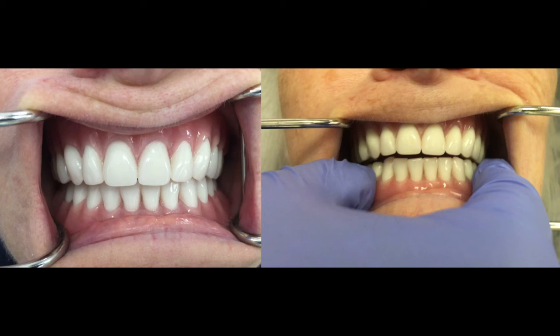So when you check the occlusion in a denture, be careful not to rely on the patient's habitual bite, because the denture may move and shift, so you will not be able to recognize the malocclusion or occlusion error. On the other hand, when you are checking the occlusion like on the right side, if you're holding the mandibular denture in place, then it's very clear to see how far off the occlusion is.